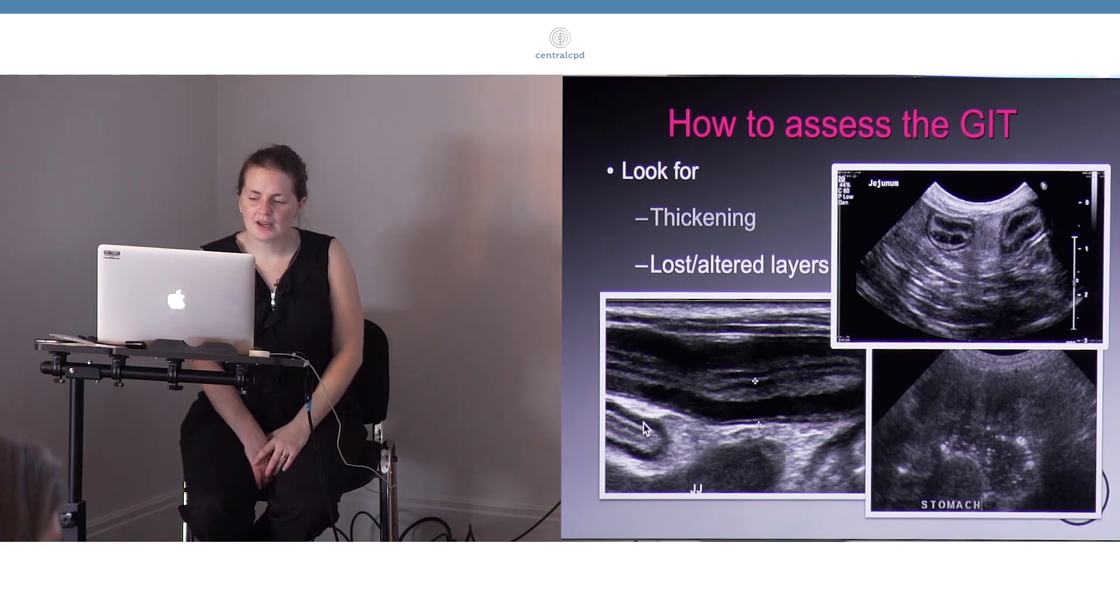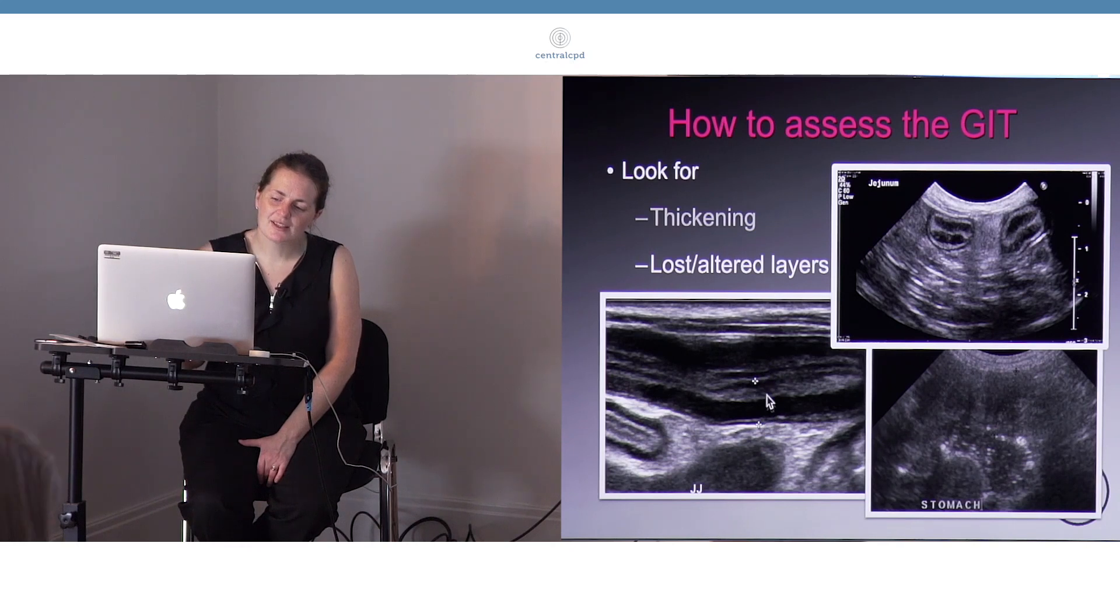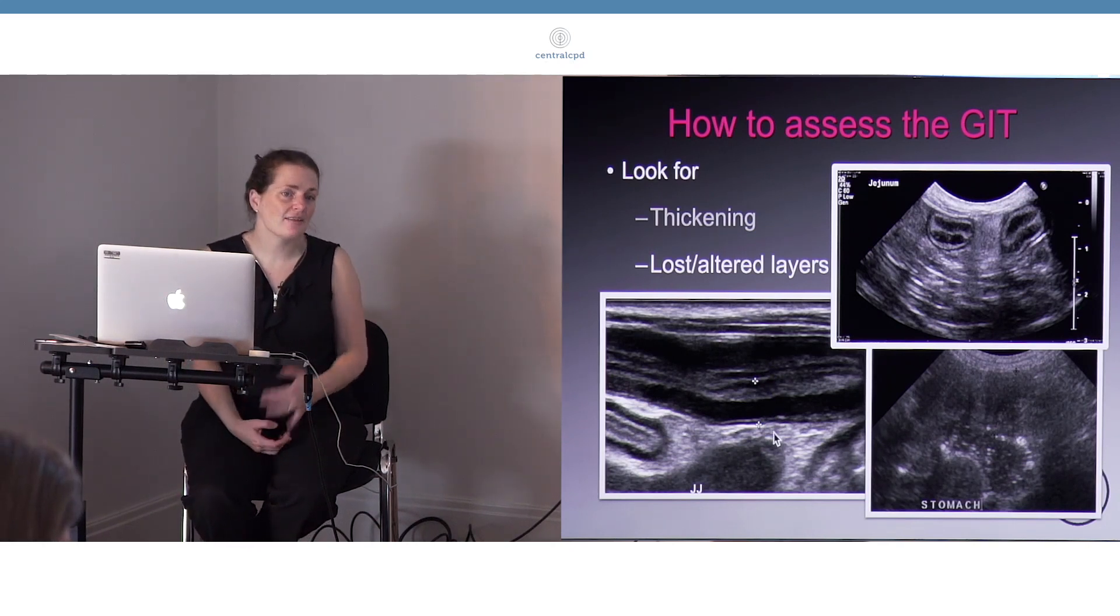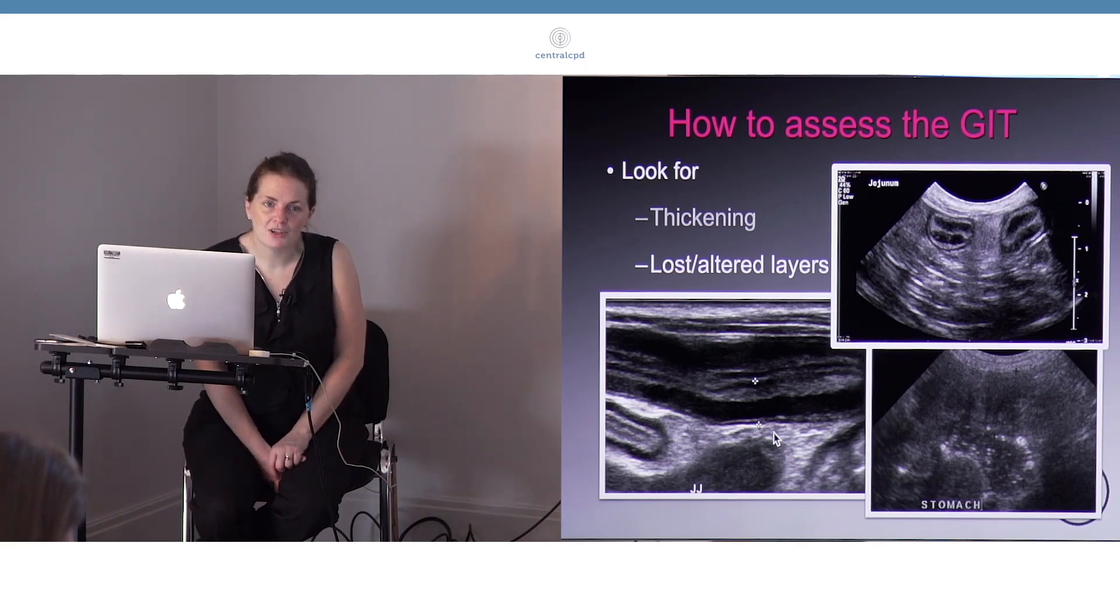So altering the distribution of the layers for sure would be a feature that we'd see with a lot of diseases. This area where we get increased numbers of layers is something that's being increasingly recognized. I think as our ultrasound machines have got better, there's been a bit of a flurry of papers publishing on these extra lines that we see.